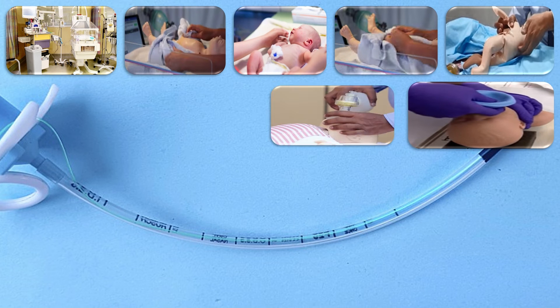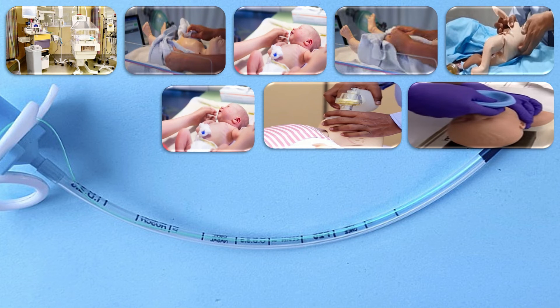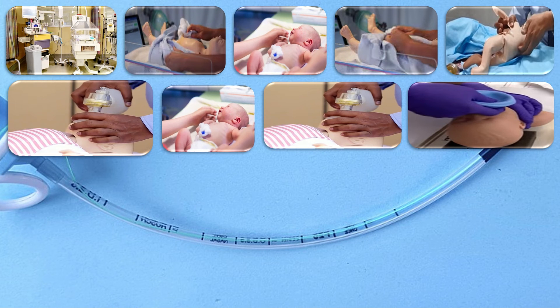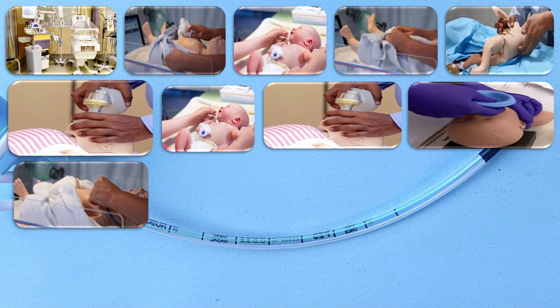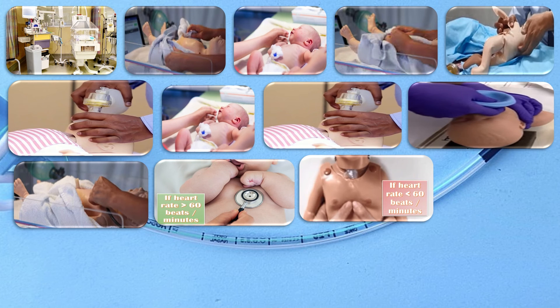Give five rescue breaths using the ambu bag in the neutral position — head in a neutral position with chin lift. After the initial five rescue breaths, assess the baby for color and breathing. Give five more rescue breaths by making a seal with the ambu bag. If the baby is still not breathing, check the heart rate with a stethoscope. If the heart rate is more than 60 beats per minute, continue bagging at a rate of 40 breaths per minute, stopping every two minutes to check if the pulse or breathing has improved. If the heart rate is less than 60 beats per minute, start chest compressions at a ratio of three compressions to one breath.